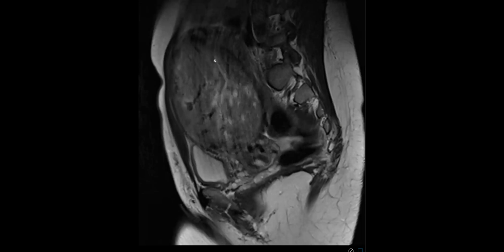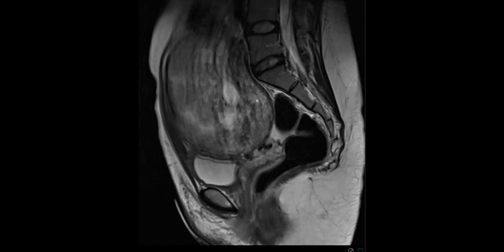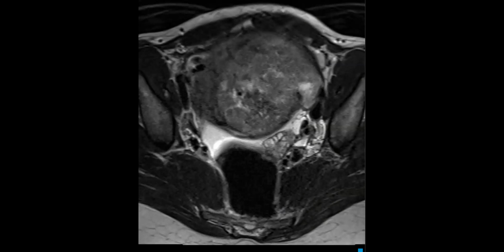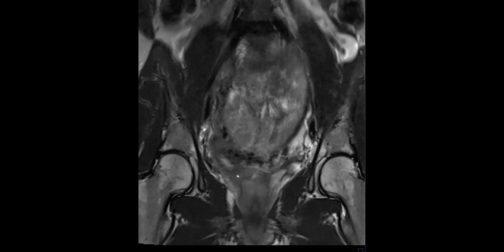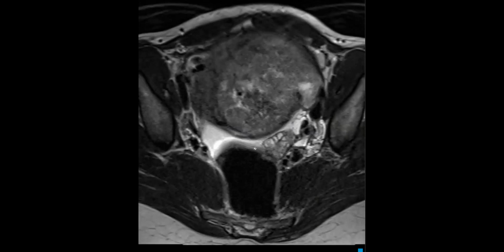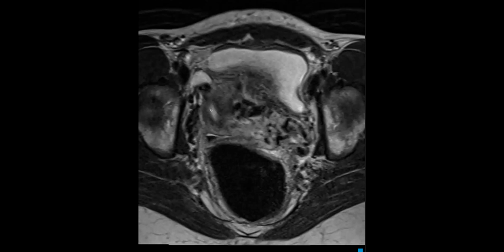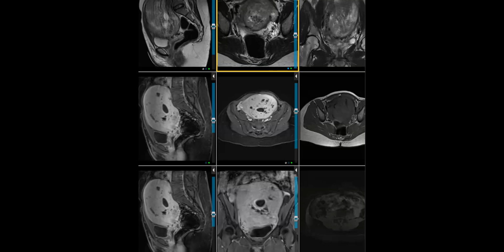So this is a very simple case, but the discussion, I'd like to get your opinion. How do you approach the diagnosis? So this is a 35-year-old female, and obviously we see something is wrong here, a mass in the abdominal pelvic region, which is pretty heterogeneous on T2. And again, no suspense, but this is coming from the uterus. For example, here we can see the endometrial lining. We can see it better on axial as well. Here you can see the cervical canal extending to the endometrial canal, and from this area we can see this large lesion is arising.